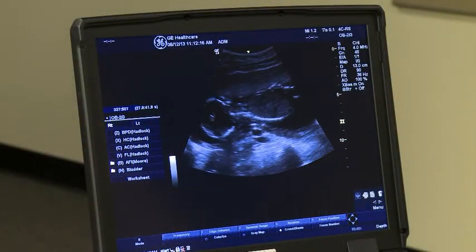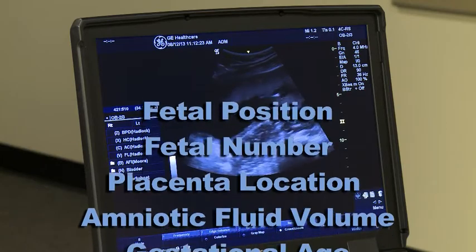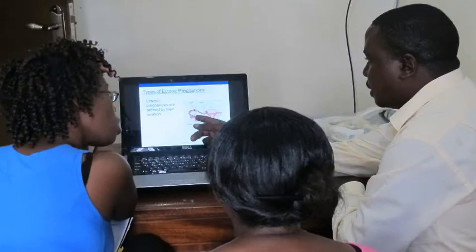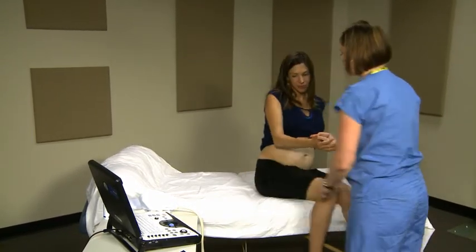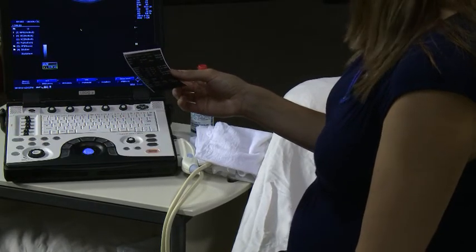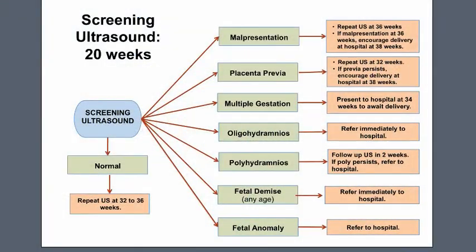You have now completed the ultrasound screening exam. With the screening exam completed, you will know fetal position, fetal number, placental location, amniotic fluid volume, and gestational age. We will spend much time in the course going over indications for hospital referral. Once you have completed your ultrasound, have the patient sit up, then record the patient's ultrasound results. After completing the patient's records, explain the results of the ultrasound. For instance, by knowing the placental location, you can tell if there is placenta previa or not — if there is, you should send the patient to the hospital for delivery. Also, you will know if the growth of the fetus is normal.